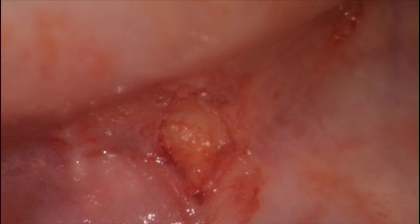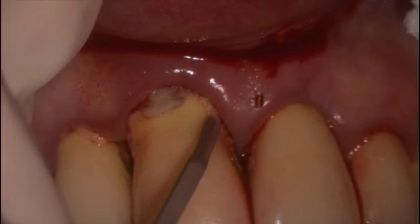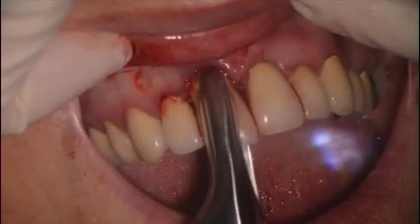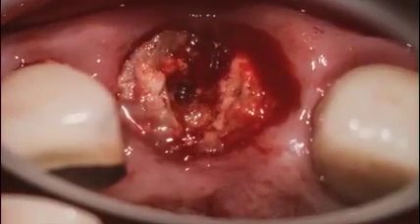The central incisor, tooth number 8 or tooth number 1-1 in this case, had class 3 mobility and was very loose, so it needed to be removed. We're using a micro blade — a small surgical blade used in ophthalmics — to release the gingival cuff around the tooth. We're removing the loose fragment, which in this case was just the crown, and here you can see the retained root.